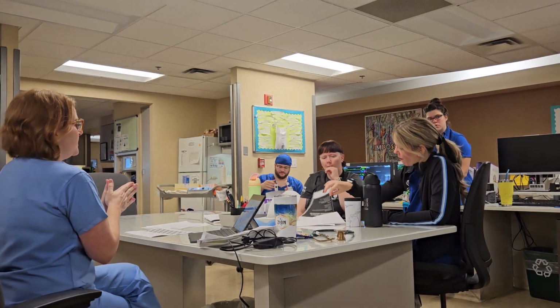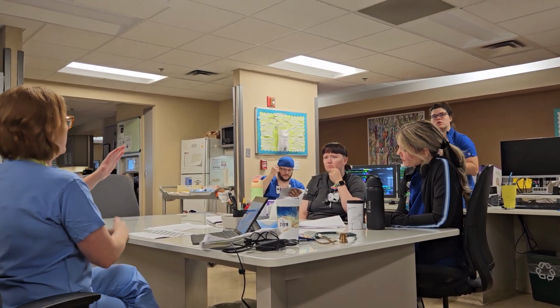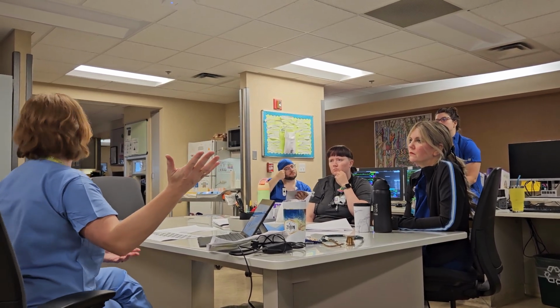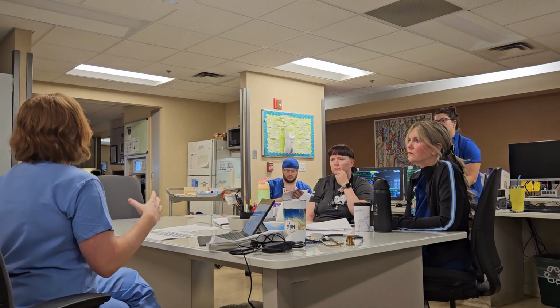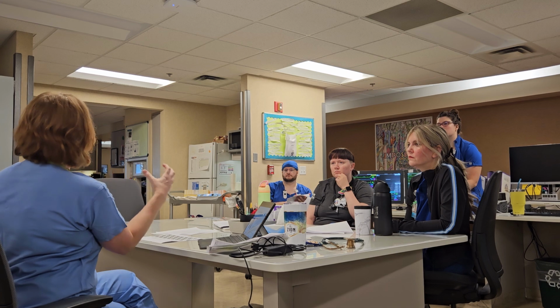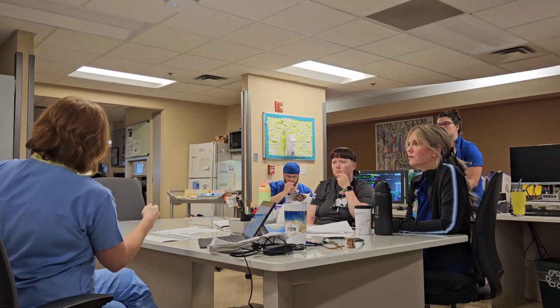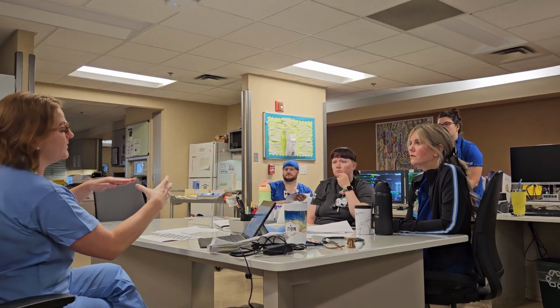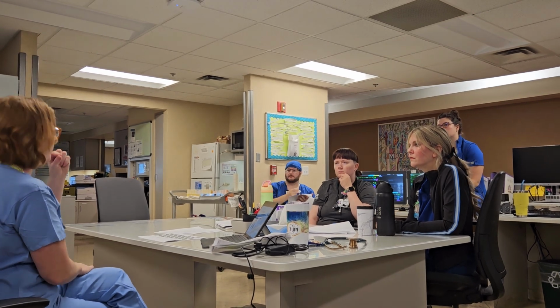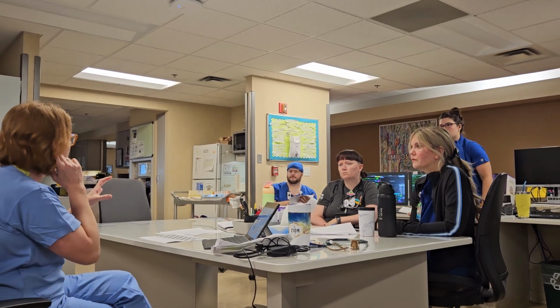So a word on lung compliance. In volume-based ventilation, we set a certain volume at a certain rate. The ventilator will tell us what the airway pressures are. If the compliance is high, like in a 40-year-old encephalopathic person who doesn't have lung disease, if we give them a certain amount of flow, it will result in a beautiful target volume because their lungs are very stretchy, their compliance is good. But if they have poor compliance, we can use the same amount of flow to try to deliver that breath and they only get a volume of 250. It's like blowing up a balloon, and that initial breath takes more force to increase, which is kind of more like PEEP, but in any case.